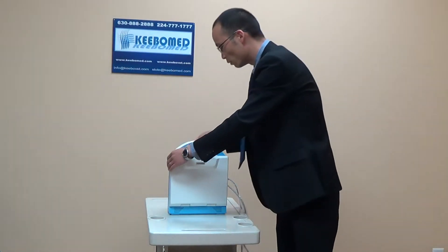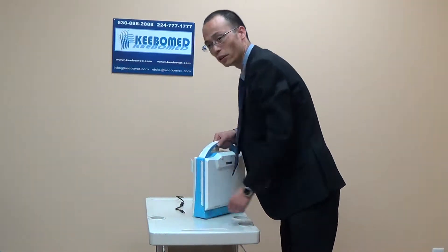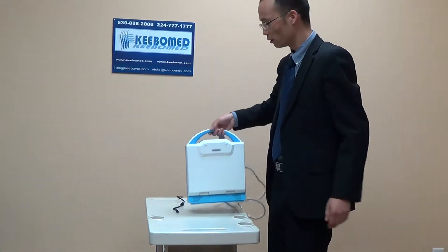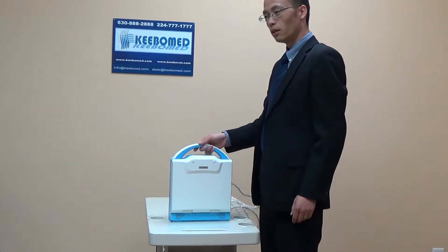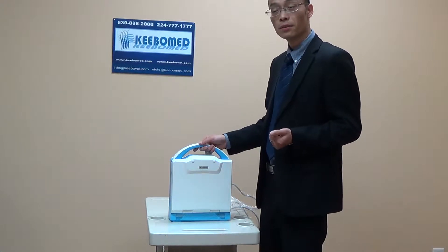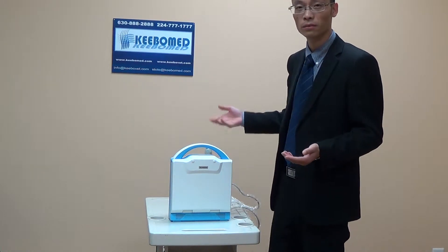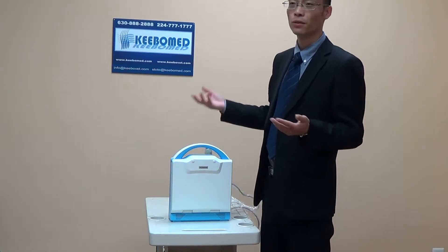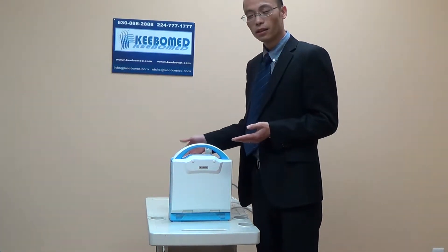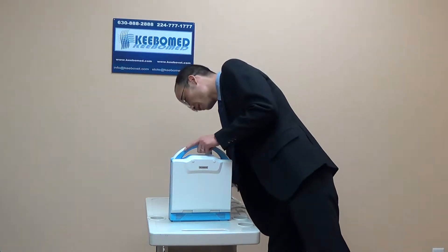This model comes with DICOM as standard configuration. As you see here is the DICOM part. As I know, there is no DICOM for veterinary ultrasound as standard configuration in other models. So this one helps — you can do many things with DICOM, like print and transfer images to computer. Most importantly, it is standard, so you do not need to pay extra for this.